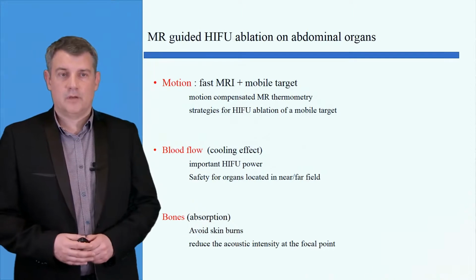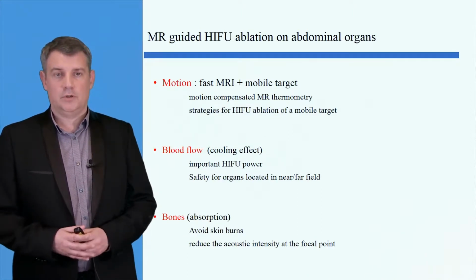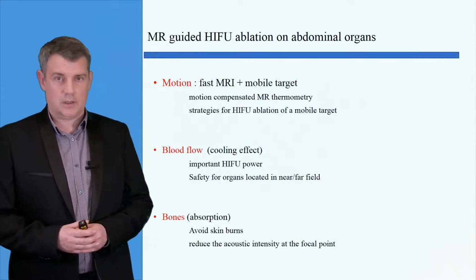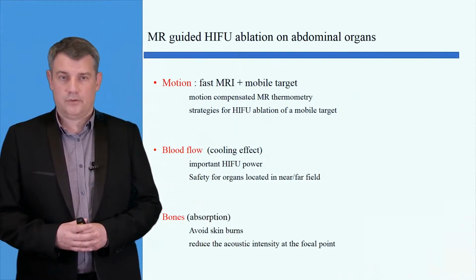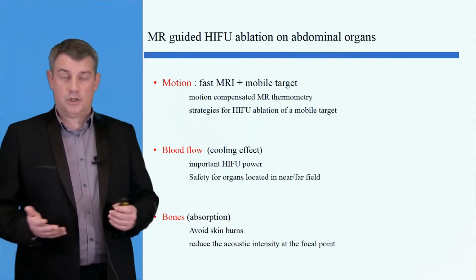Well, I've shown you that it's possible to use MR thermometry to monitor radiofrequency ablation of the heart. However, this course is about MR-guided HIFU. So can we apply this technique for the treatment of abdominal organs, for example the liver? What are the challenges here?